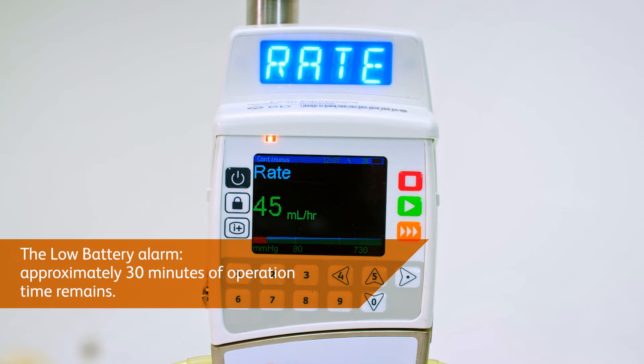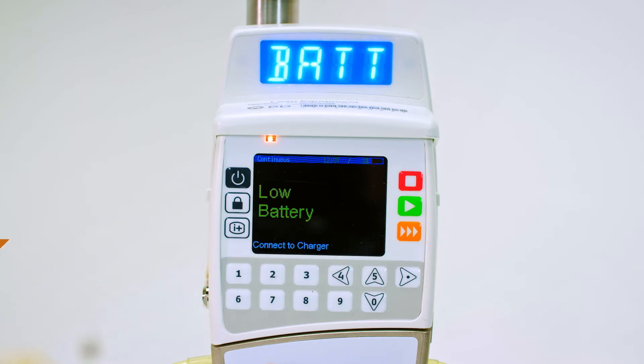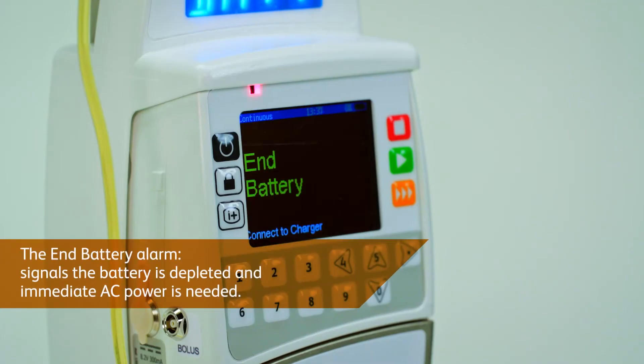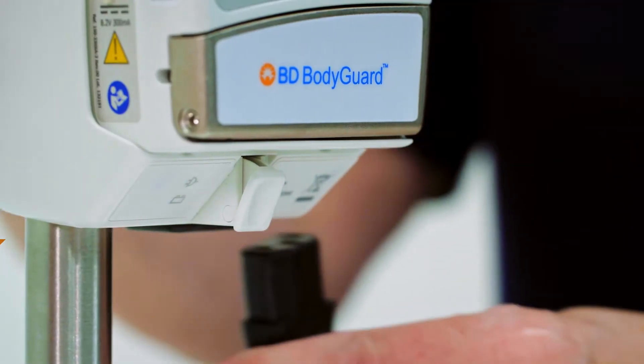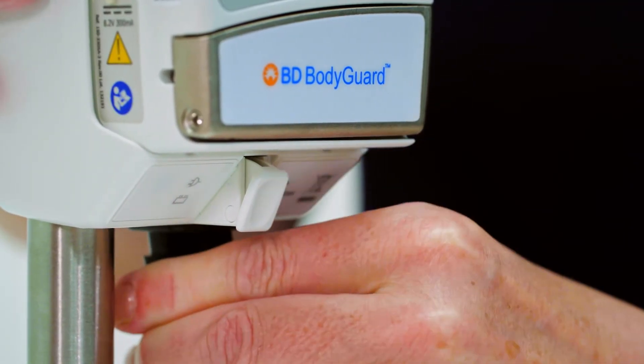The low battery alarm signals that approximately 30 minutes of operation time remains, to source and connect to a power supply. The end battery alarm signals the battery is fully depleted and that immediate AC power is needed to continue operation.